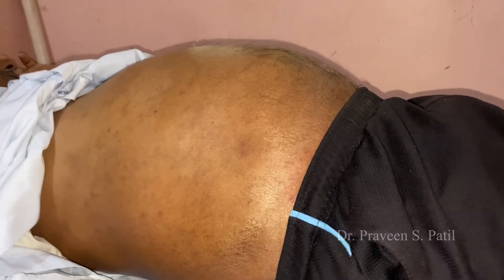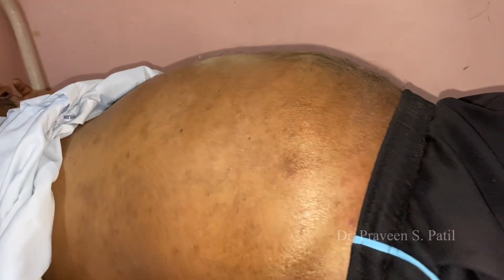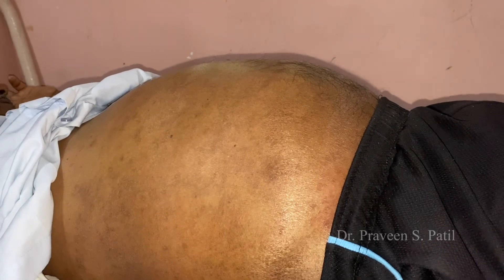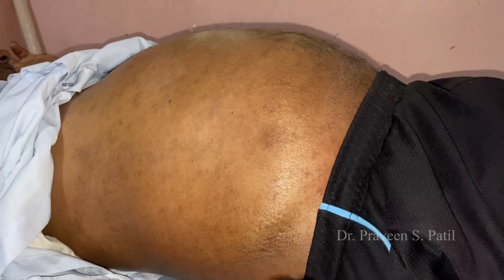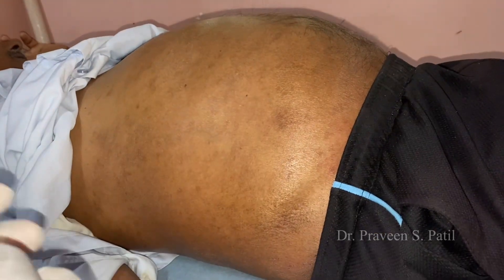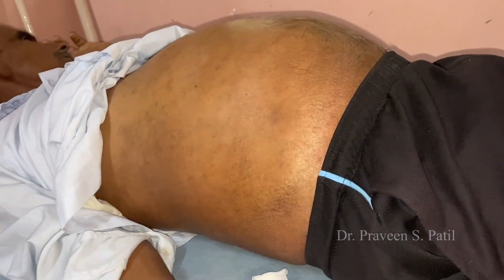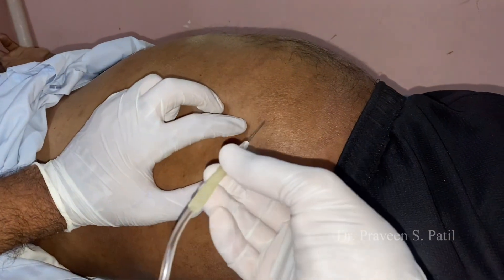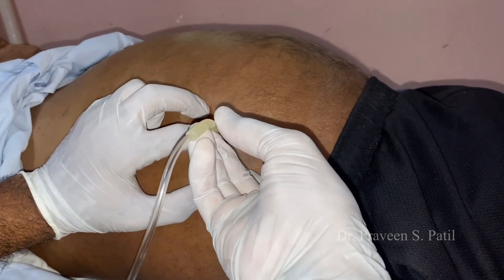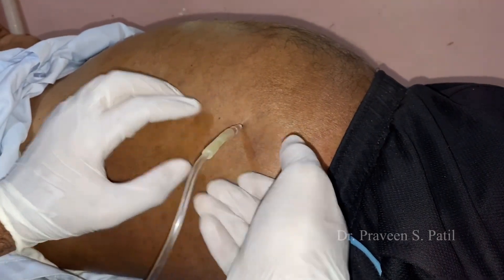Hi everyone, this is Dr. Pravinas Patil. Today I am going to demonstrate an abdominal paracentesis. The indication for the procedure is for the evaluation of a variety of abdominal problems, including ascites — whether exudate or transudate — or to rule out malignancy in the peritoneal fluid, and in cases of abdominal injuries, acute abdomen, and peritonitis.